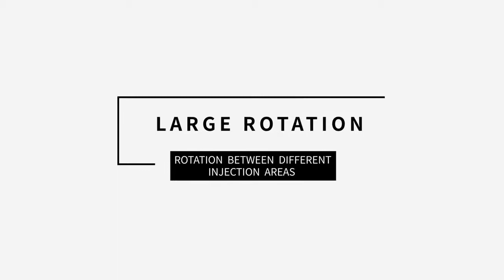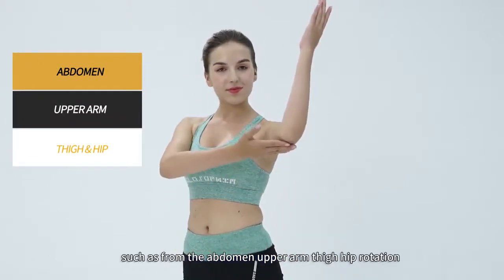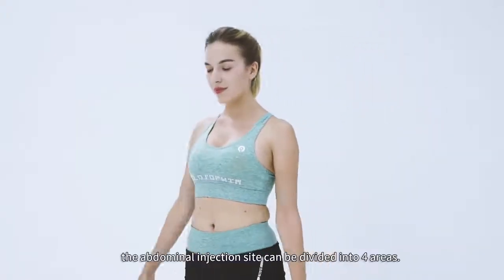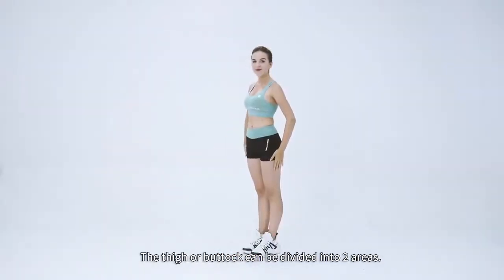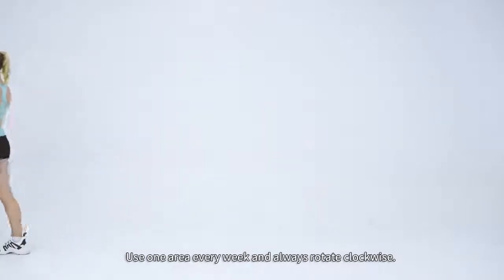Large rotation, rotation between different injection areas, such as from the abdomen, upper arm, thigh, hip rotation. Small rotation, rotation in the same injection area. The abdominal injection site can be divided into 4 areas. The thigh or buttock can be divided into 2 areas. Use one area every week and always rotate clockwise.